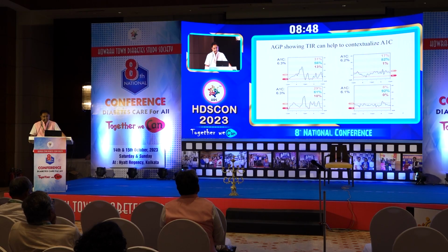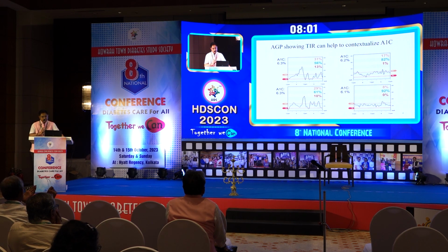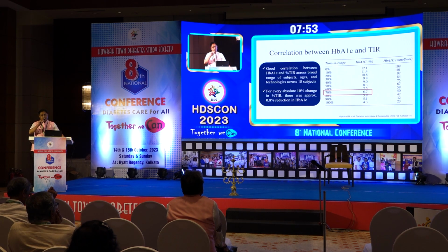Coming to a similar kind of slide I have already presented. A patient with an HbA1c of 6.3, then a patient of 6.2, 6.1. So it's almost a similar category of patients with good glycemic control, as we think from the HbA1c. But what we can see here, in the first patient, the time in range is only 56%, but time below range is almost 13%. Whereas in the second patient, it's a bit better, 61%, but still low against the criteria. Whereas the third patient, 6.2%, has 82% time in range and less than 1% time below range. In the last patient, with 6.1% A1C, we can see 92% time in range, 8% time above range, and 0% time below range. So this should be the patient with glycemic control, less glycemic variability, and a good HbA1c report.